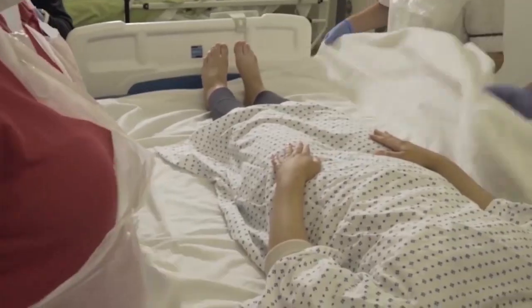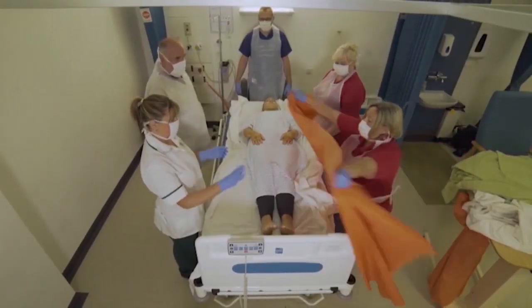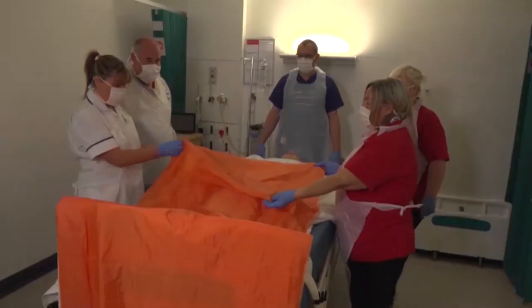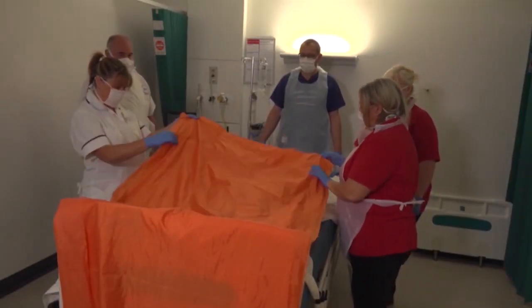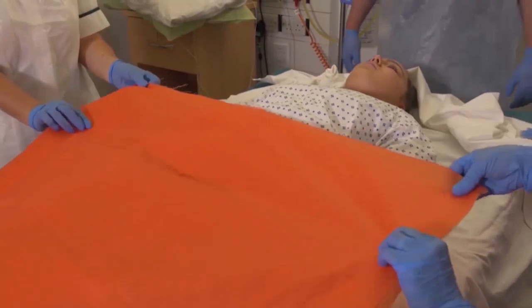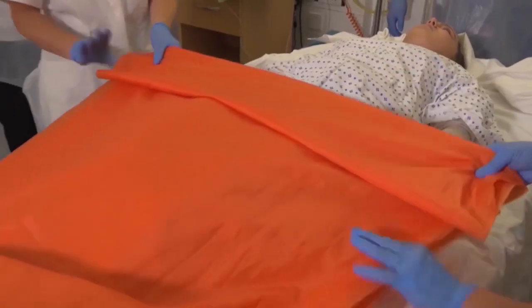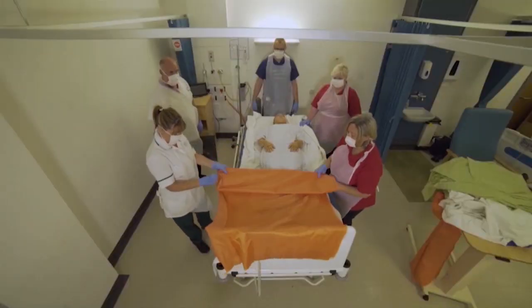What we're going to do with the slide sheets is we've got two slide sheets, one slide sheet on top of the other, lined up, and we're going to do five-inch folds all the way down — five inch.